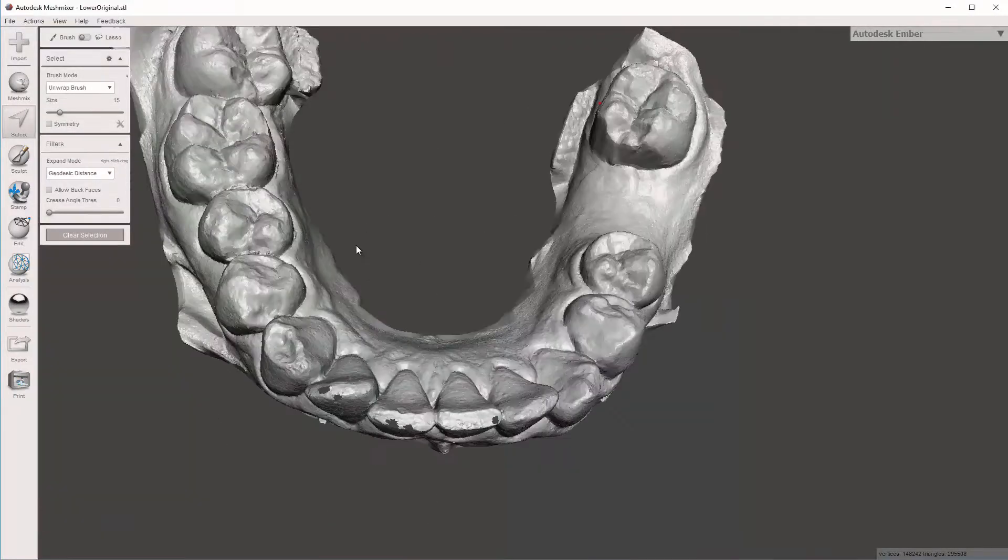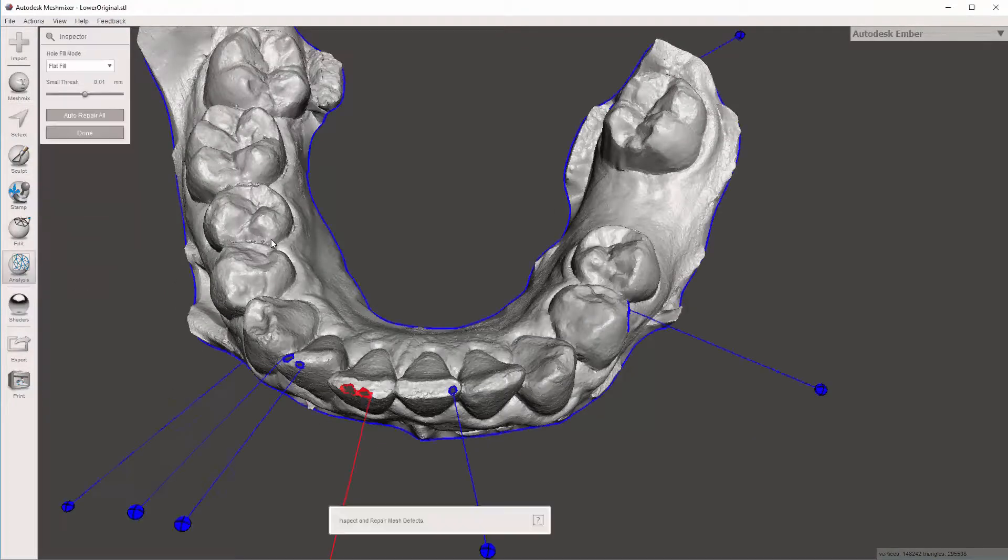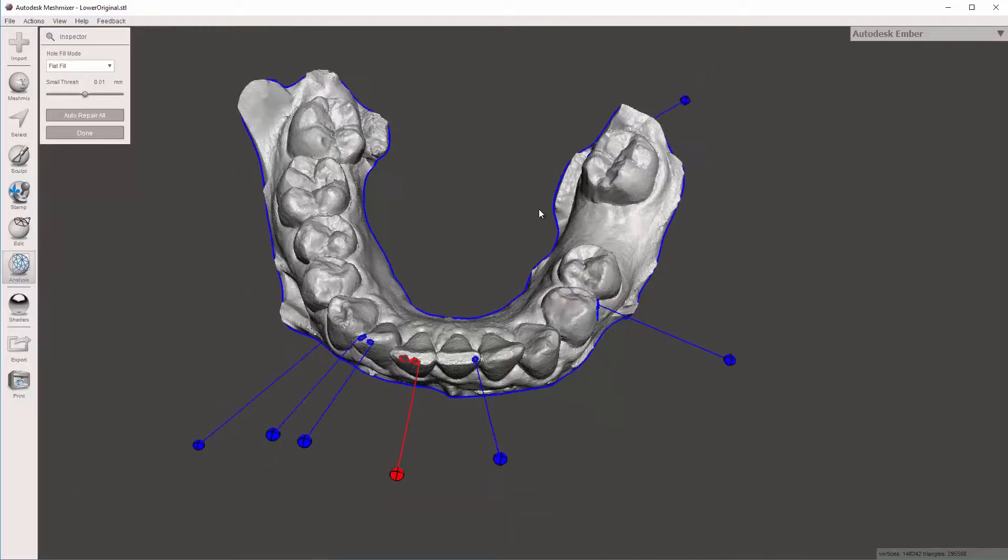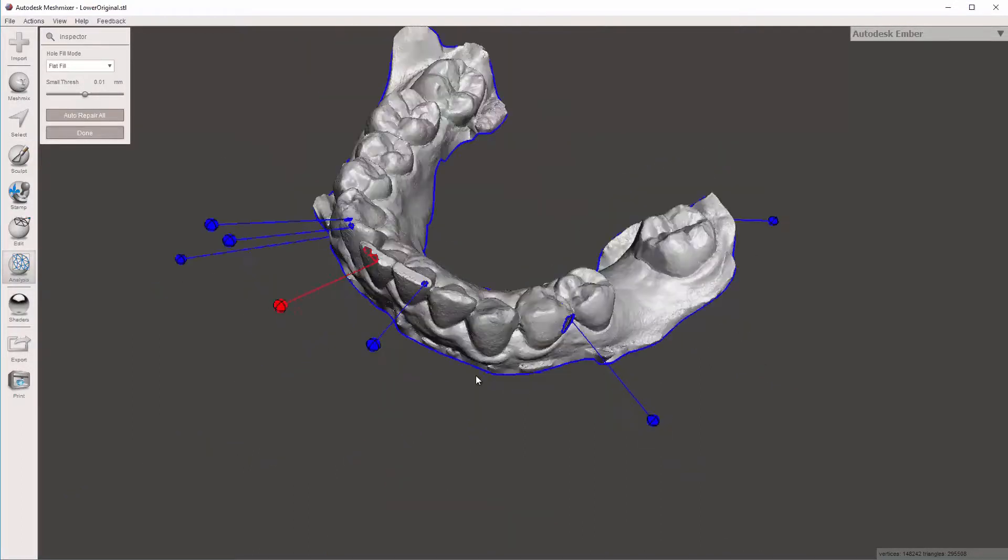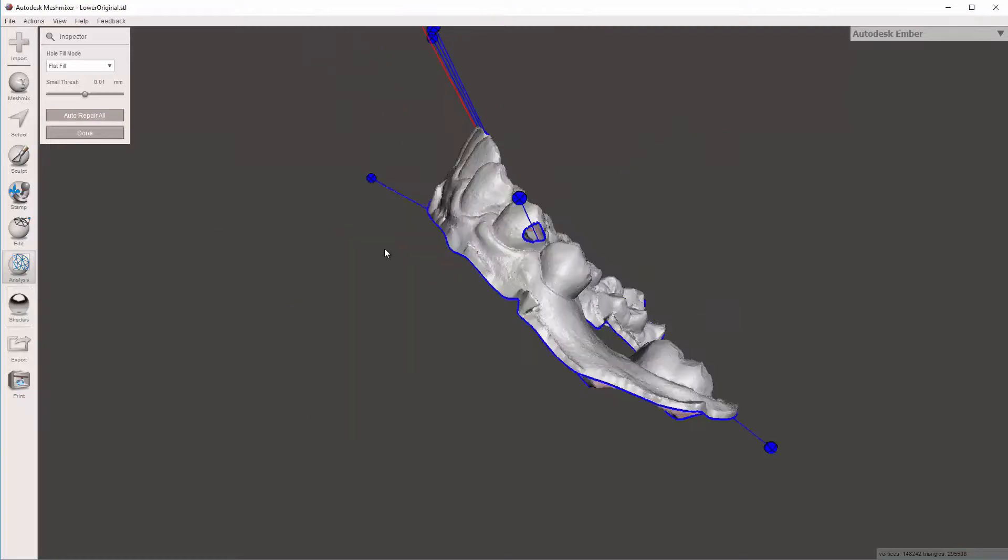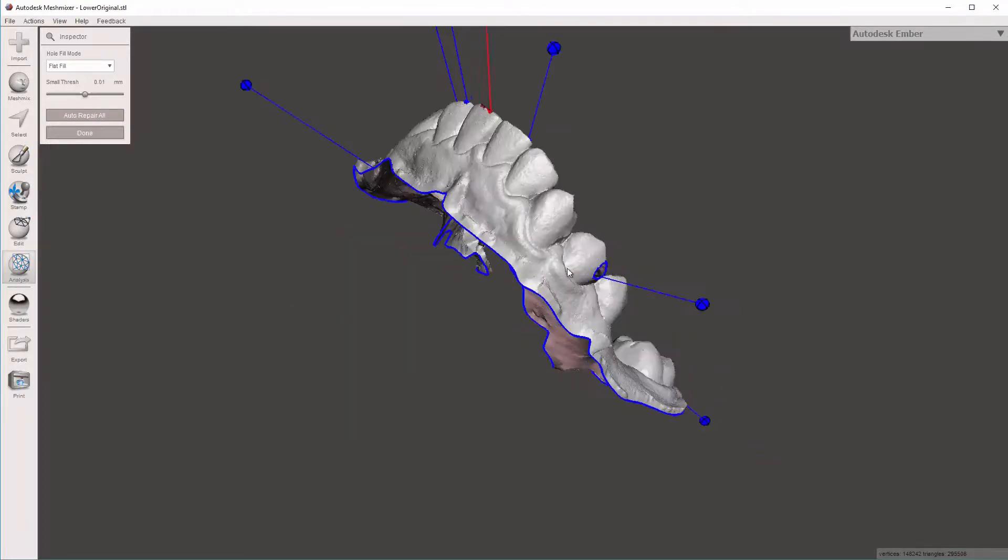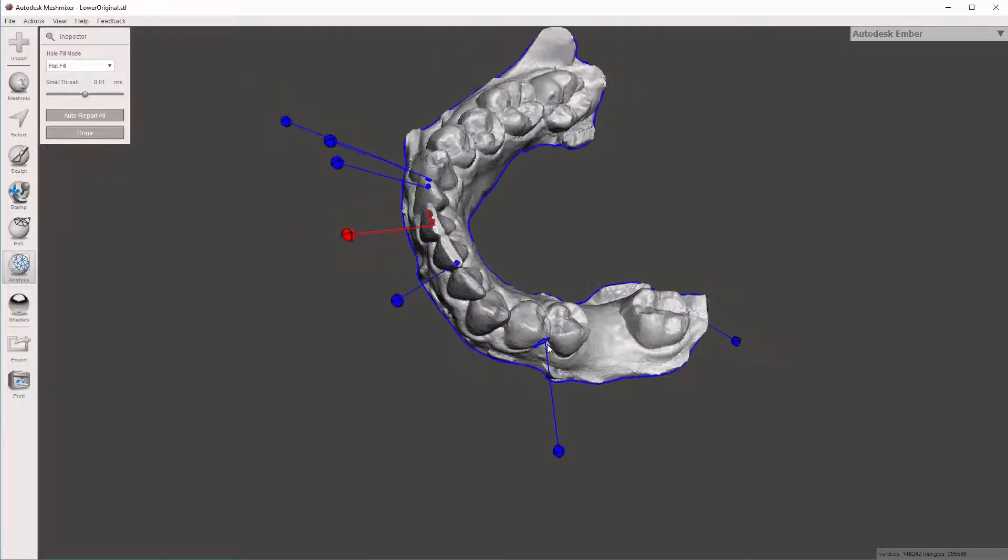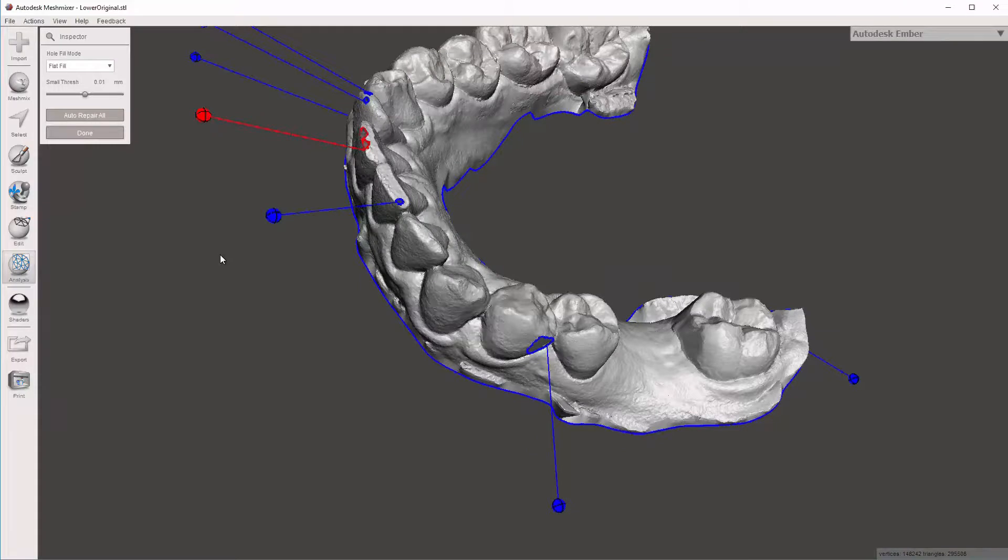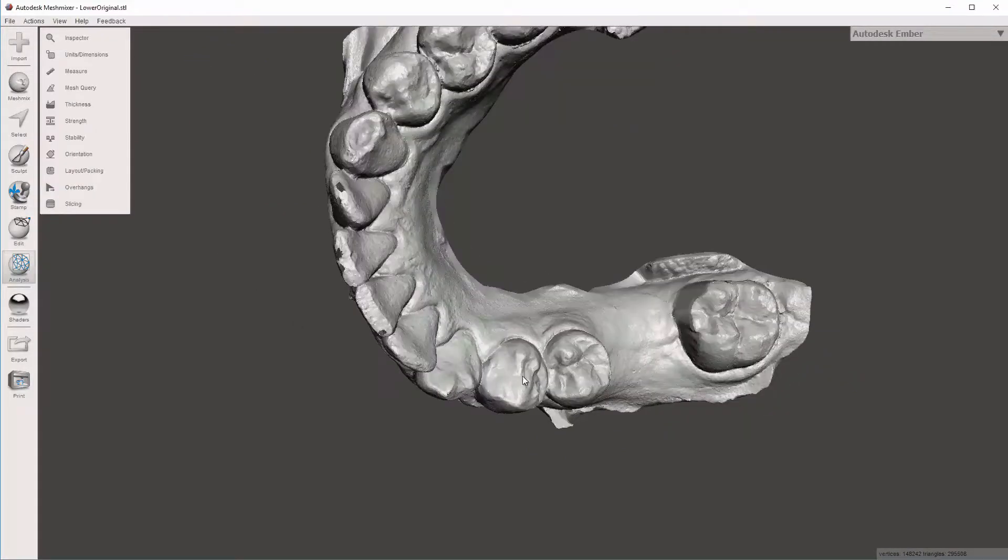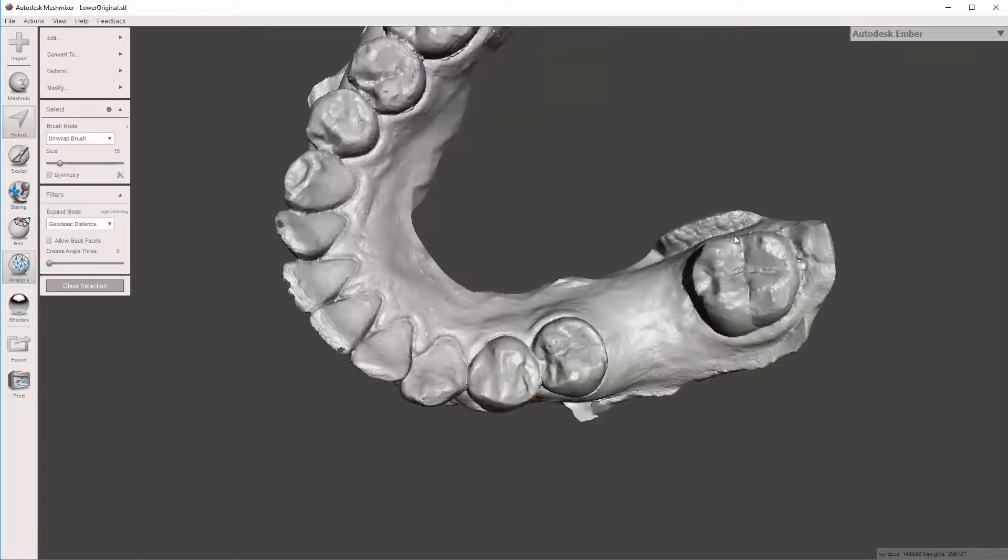Now the last thing we need to do is we need to fill those holes. To do so, I'm going to go over to the Analysis button. I'm going to hit the Inspector. Now this is going to show me any errors in the model, any holes. And one thing that's important to realize is that hole should not be there. So that most likely came from one of my other edits. So let's see when. Let's hit Escape. Hit Control-Z. Control-Z. Control-Z. Aha.